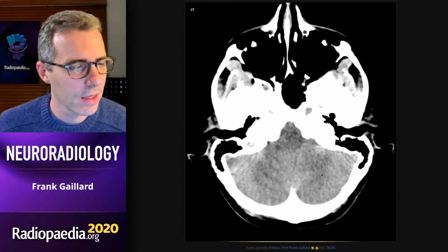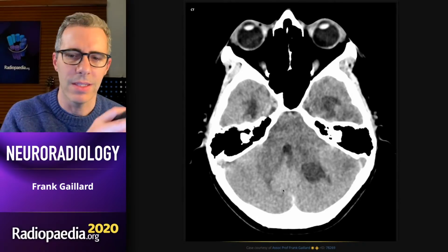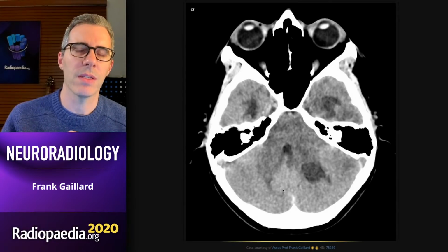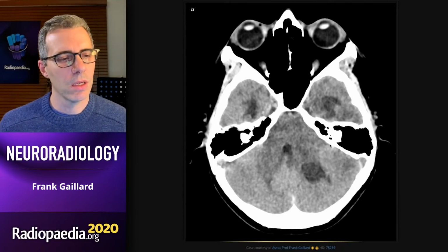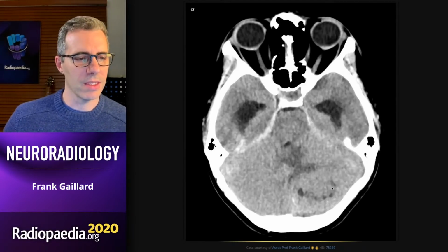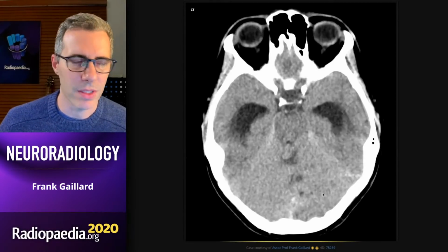Radiology, this side. And even on non-contrast, we can see different density components. Now, this component, I know that this is abnormal because I've seen the contrast studies and I've seen the MR. But beware of calling an abnormal dense vermis, because it's not uncommon for it, especially if it's pushed a little bit, to appear somewhat hyperdense. But this component is definitely abnormal. And this low attenuating component is definitely abnormal. And the more you look, the more you think maybe all of this hemisphere is abnormal.